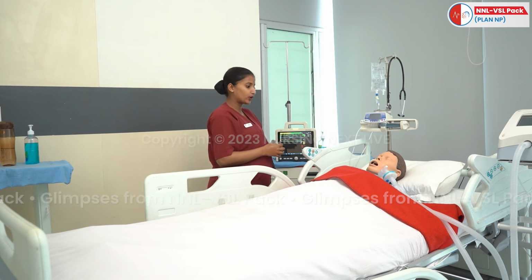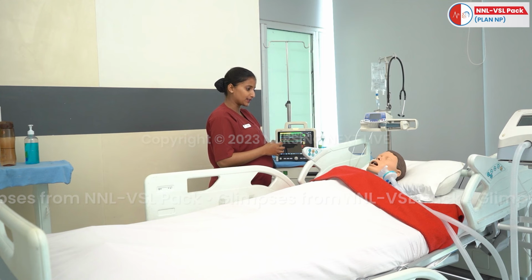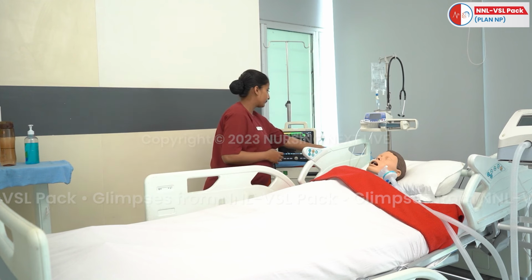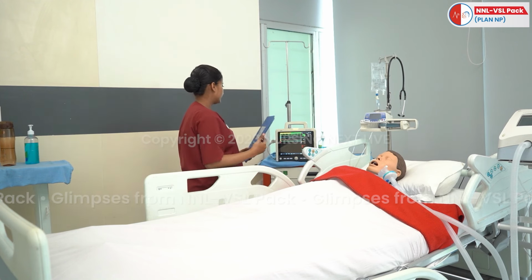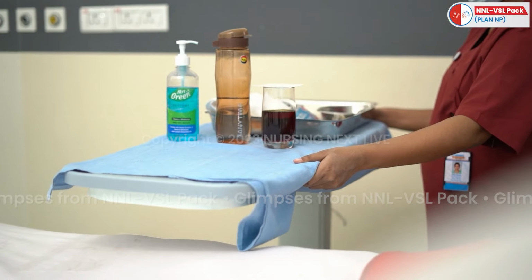Ma'am, according to the doctor's order, I need to provide you the NG tube feeding. So I will prepare my articles and will come back within a few minutes. Check the vital parameters. Arrange the articles.